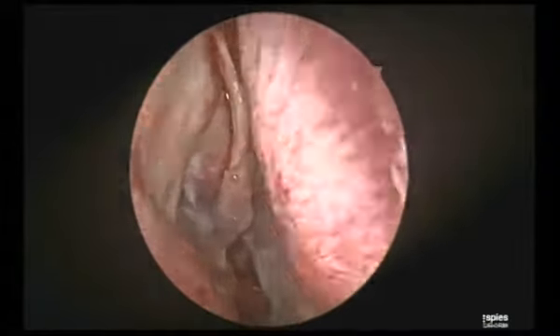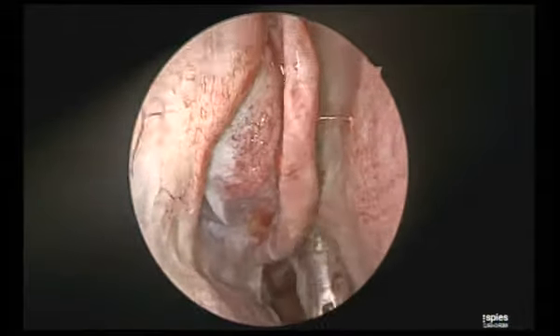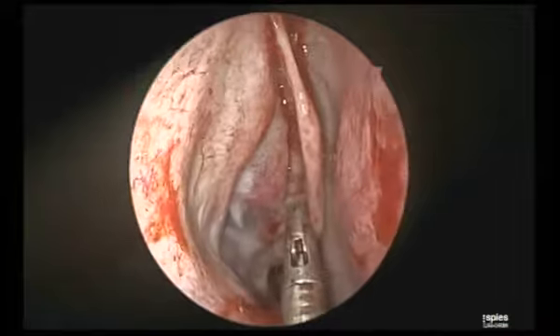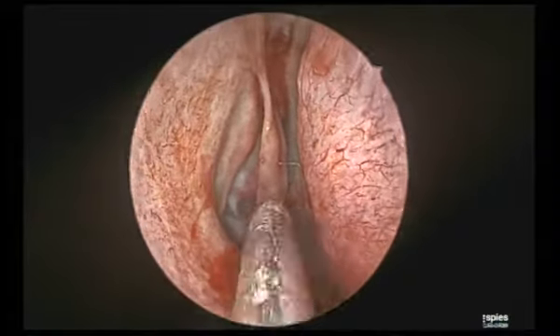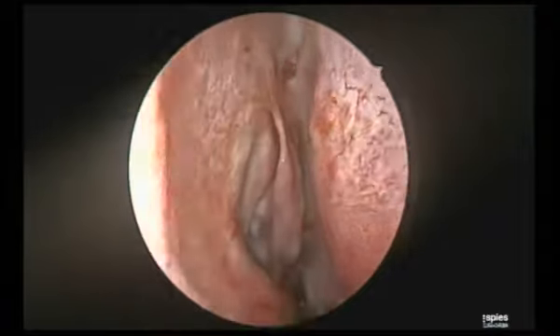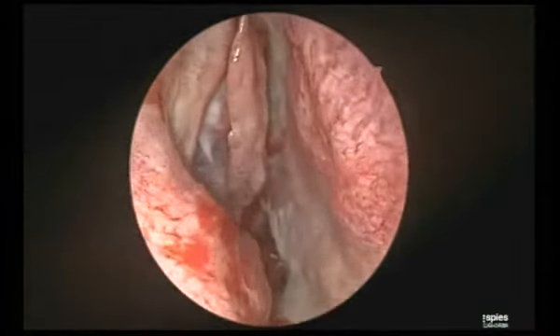I don't say it is useless. If you can preserve it, you should. But in this situation, I am not going to preserve it completely. I have many ways to handle the turbinate. The one I showed you on the other side is microfracturing. But this floppy turbinate, and this happens mostly when there is polyposis medial to it, I have many ways to handle.